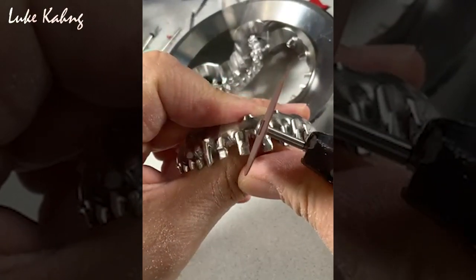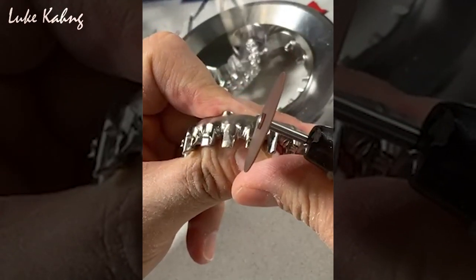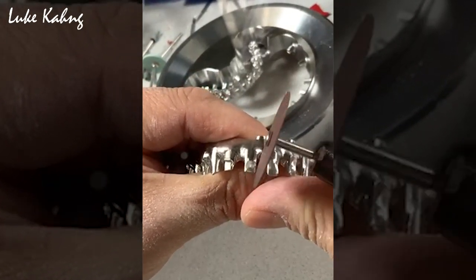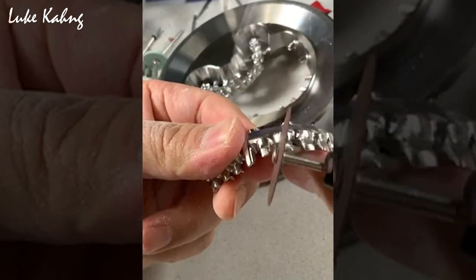The only thing is it's just a little bit more embraced open. Like this.